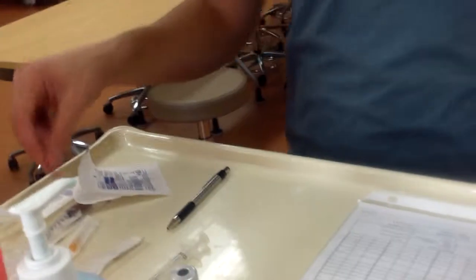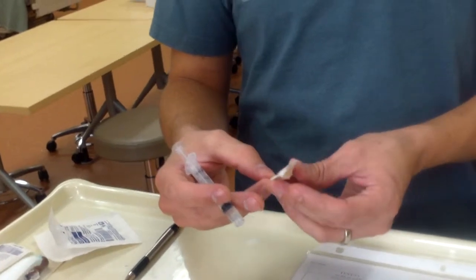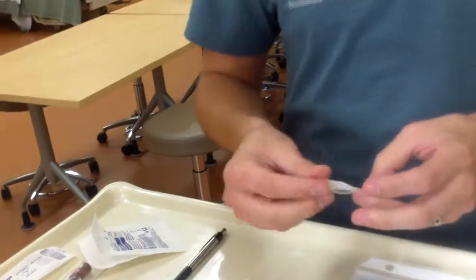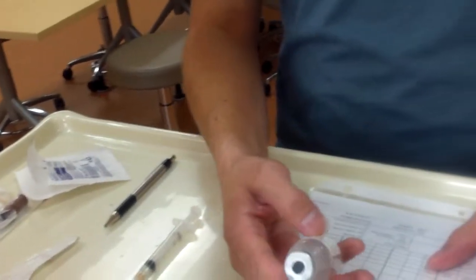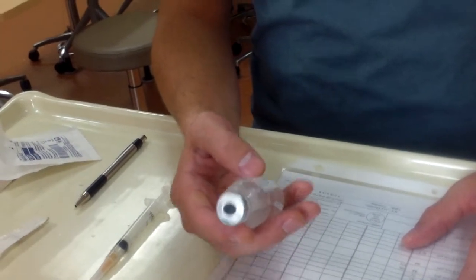And then I need to attach my needle for my subcutaneous, which I'm going to be using a 26 gauge, 3/8 inch needle. So I'm just going to go ahead and put that on there. So I have that one. So that medication's all done. My next medication going down the list, second check. The expiration date is good. And doing the same time, route, dose, medication, patient, and the right medication, so we're all good.